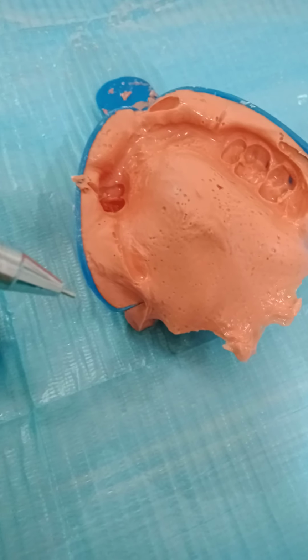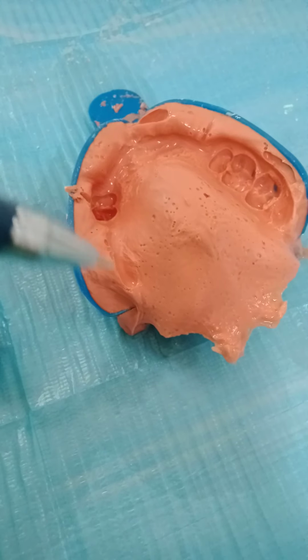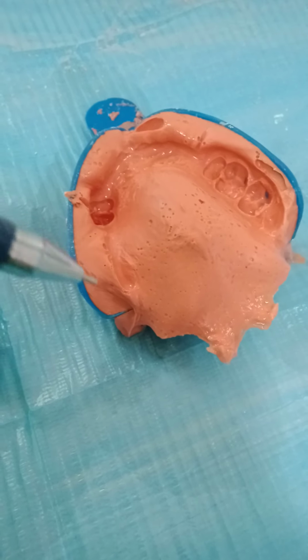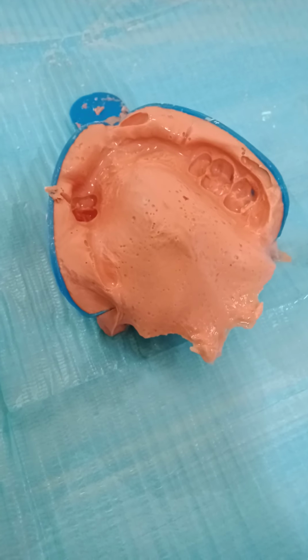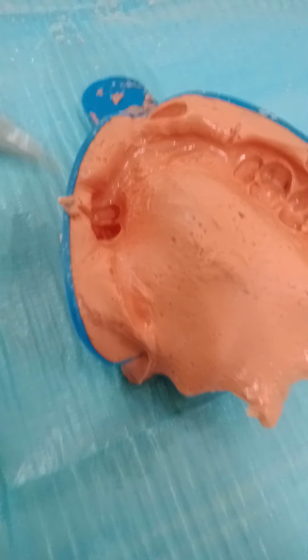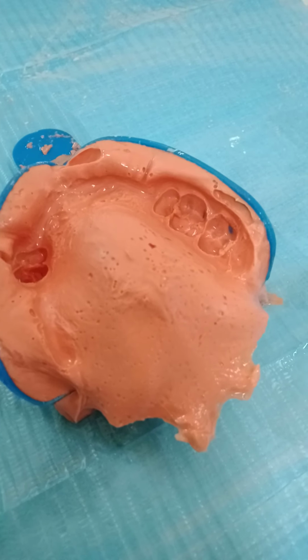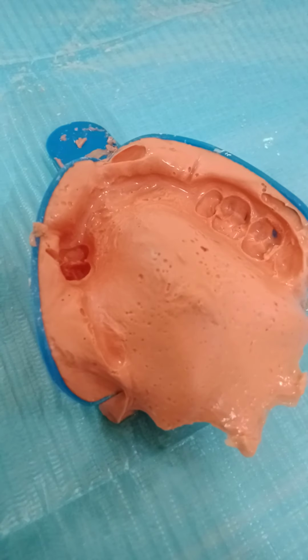So you might go with a special tray. Or I make you repeat it and add utility wax here to build up this buccal pouch, because we're going to depend on it a lot for our indirect retention. Okay? These teeth are there in the impression. I have some drag here, or an excess. Now this is just excess material.